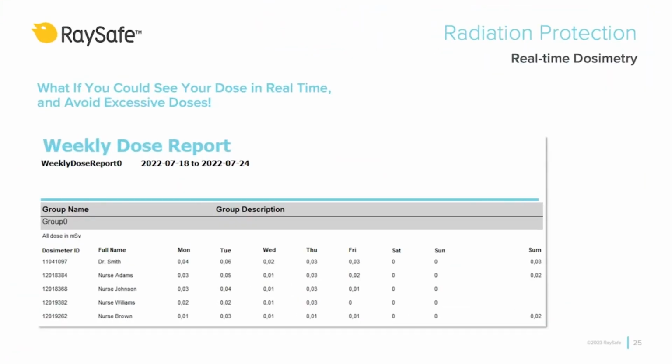Legal dosimeters are necessary, but the main drawback of these passive devices is that you will find out about your dose afterwards, after you have already received the dose. If one could have a real-time dose feedback, one could have made corrective actions in the setup and behavior during the actual procedure, heavily increasing radiation awareness and decreasing dose.